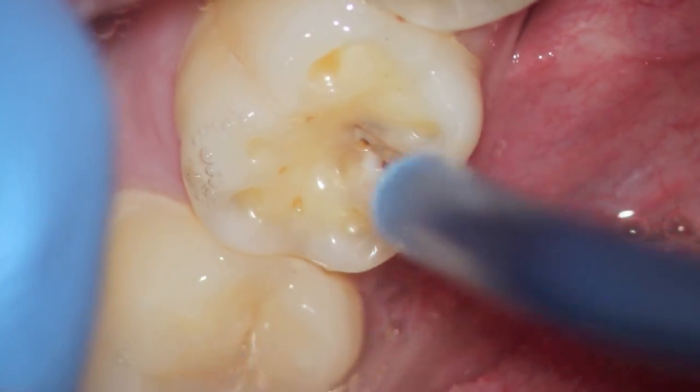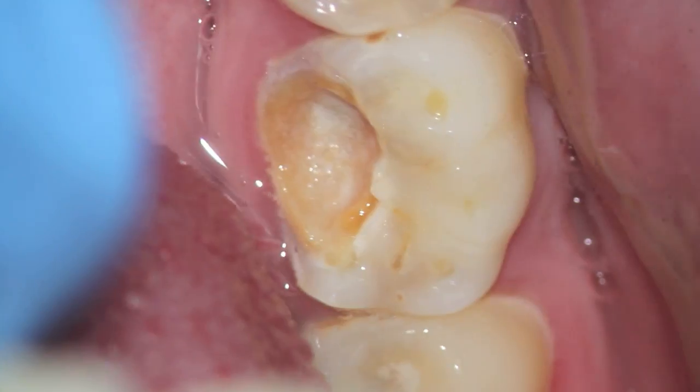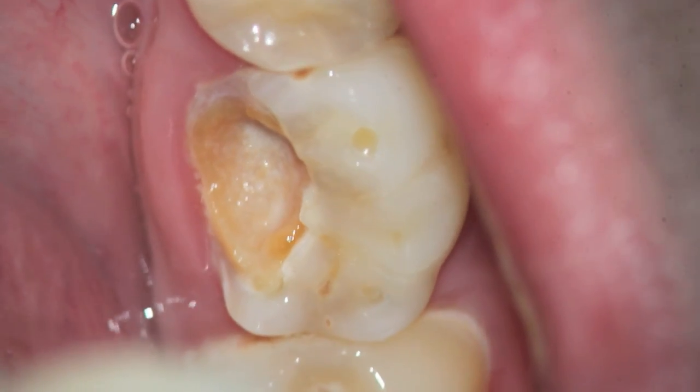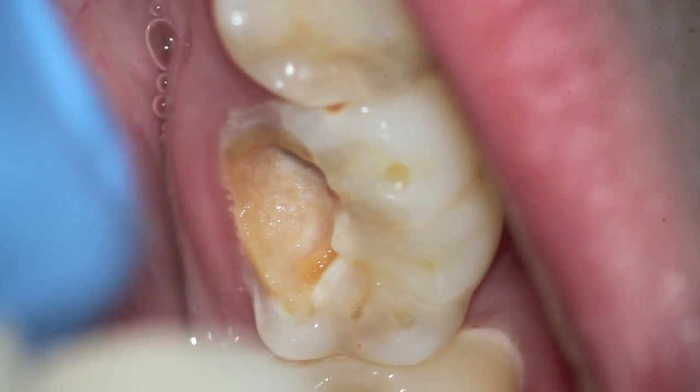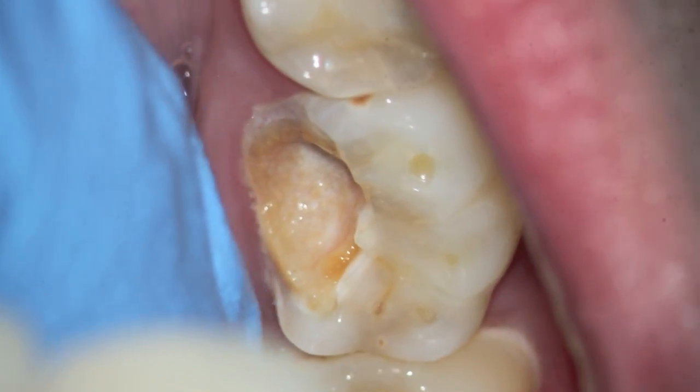That's the area on the left. You can see the decay is a little bit darker in the video, and here's his tooth, and you'll see the decay being peeled away.